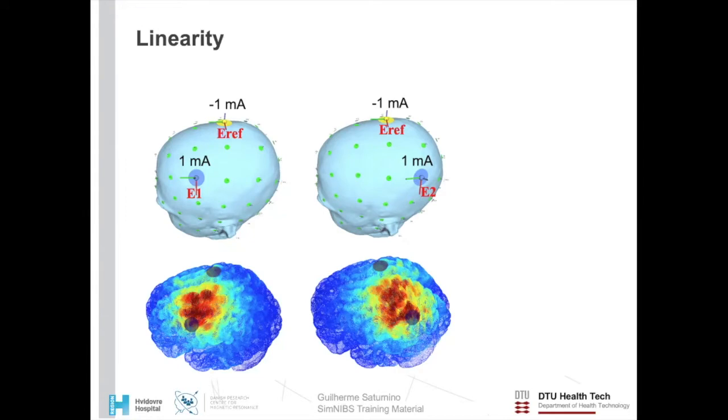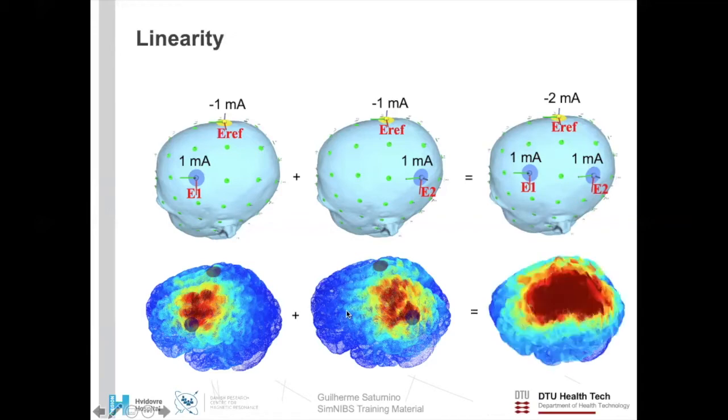The human head is a linear ohmic conductor. This means that we can calculate electric fields for new electrode setups by mixing and matching different simulation results for other electrode setups. This is extremely useful for TES optimization. Here, for example, we have two simulations. On the left, we have an anode over FC3 and a cathode over CZ. And on the right, we have moved the anode to a more posterior position CP3. Suppose that I want to calculate a new situation where I am using both of the anodes at the same time. Instead of running a new simulation, I can basically just sum the two existing ones and I get the same exact result as I would get by simulating this here in the first place.